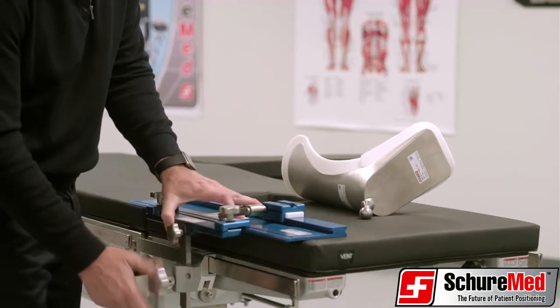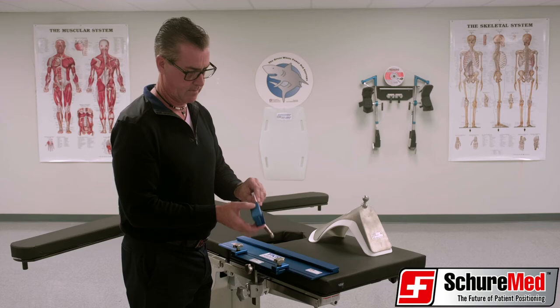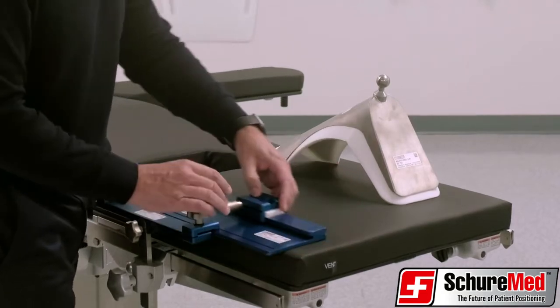Secure the base plate by tightening the two star knobs. Place the white plastic insert into the adjustable side block with the notch side facing up. Next, slide the assembled block onto the rail of the base plate track system.